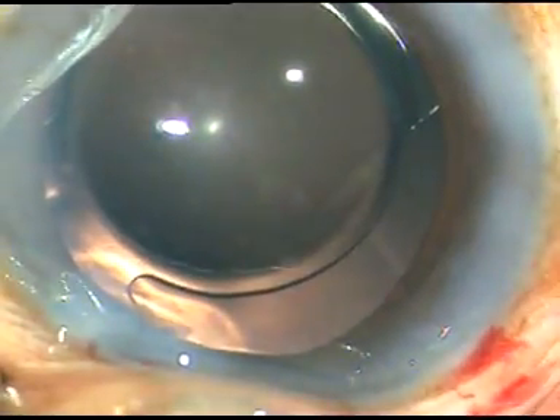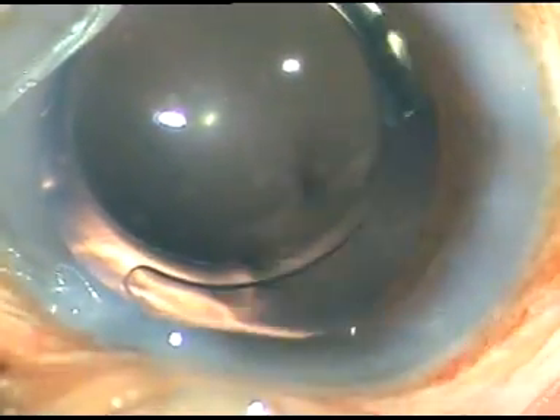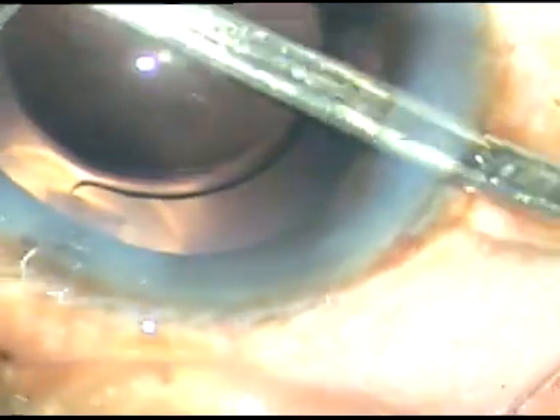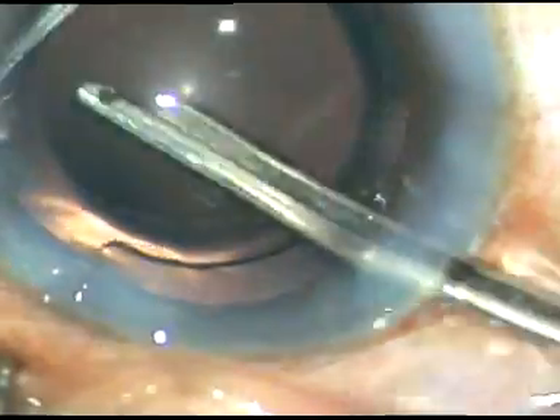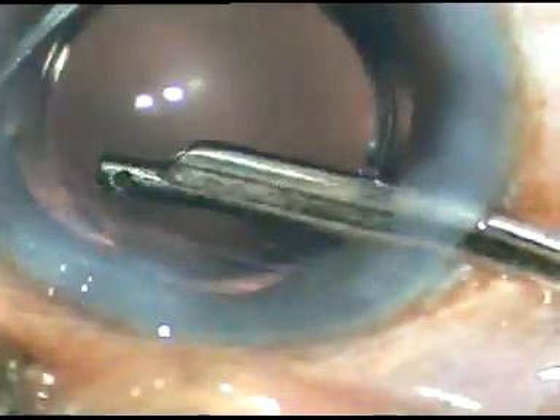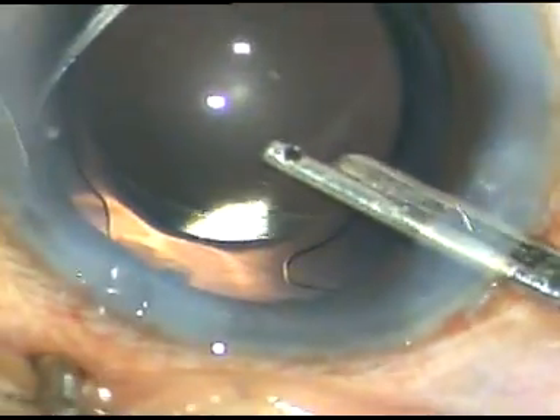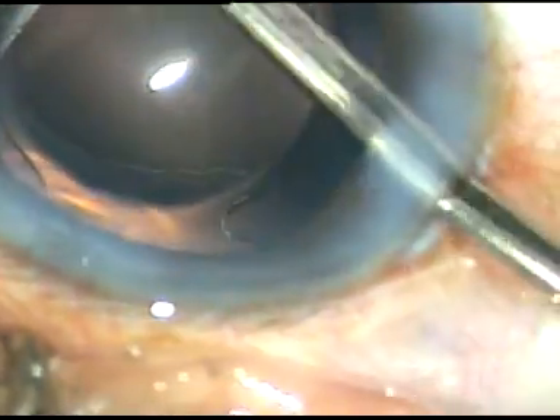Here is the final lavage. A little bit of viscoelastic that sticks to the corneal endothelium comes out during this final anterior chamber lavage.